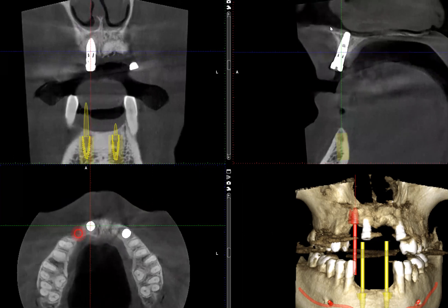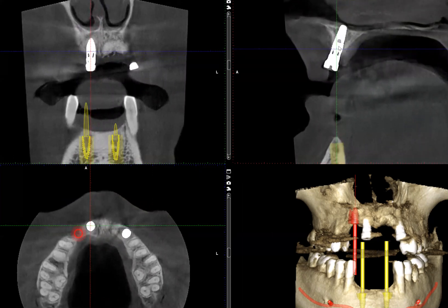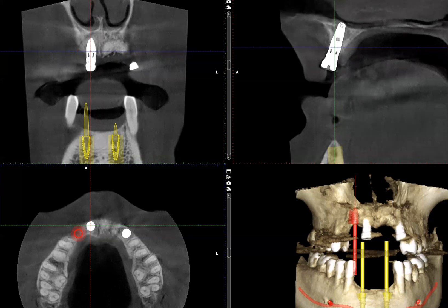If you look over to the sagittal view, we are seeing this bony landmark which is consistent with the floor of the nasal cavity. Some of you might call this the hard palate, and that's okay for this portion of the bony landmarks. You can see that the apical portion of the implant fixture definitely is located above the floor of the nasal cavity.